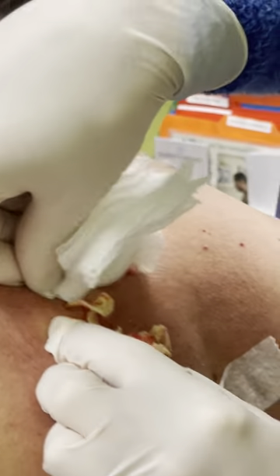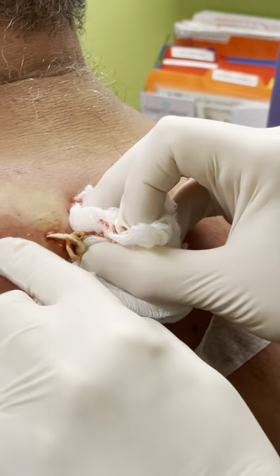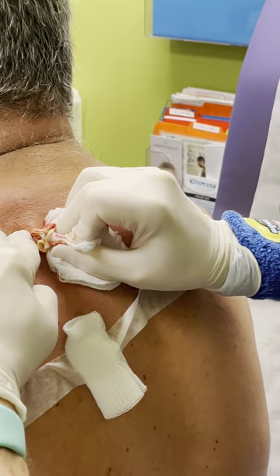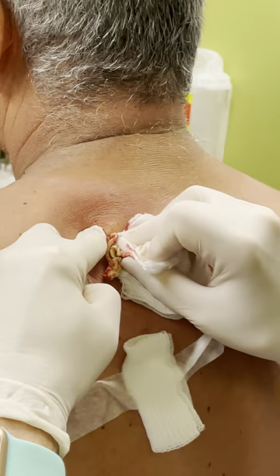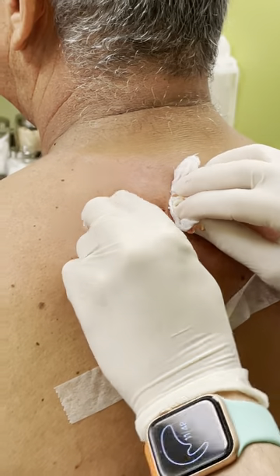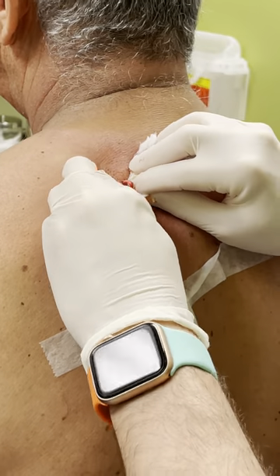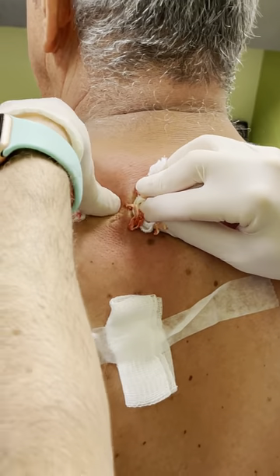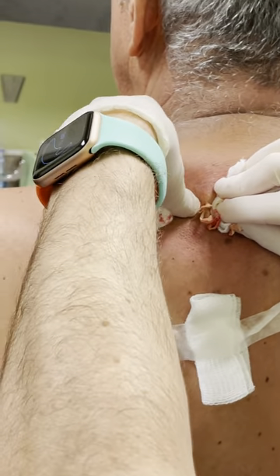The spaghetti maker, the blender, whatever you want to call it. To me, it's more like cheese from a can. When you squeeze the cheese, obviously you wouldn't want to eat it, but it has a special odor to it as well — you never quite forget. We've got it loosened up and it's really producing some nice contents for us. It looks like a pasta de dientes.